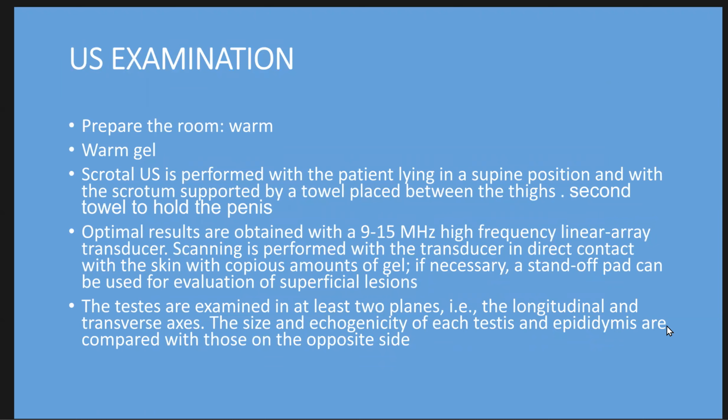For the ultrasound examination, the room should be warm and use warm gel. Scrotal ultrasound is performed with the patient lying in a supine position and with the scrotum supported by a towel placed between the thighs and a second towel to hold the penis.